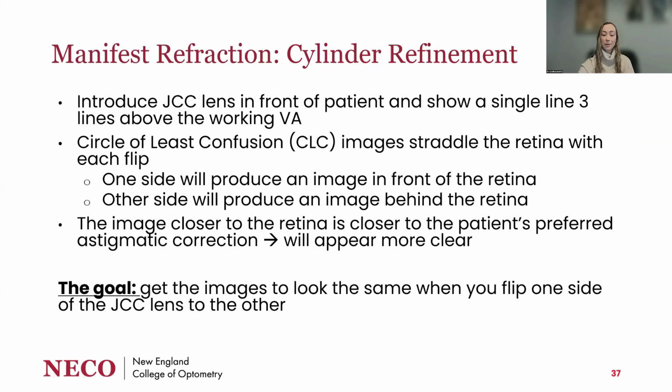We then move on to cylinder refinement. This is when we introduce the JCC lens in front of the patient and show a single line that's, again, 3 lines above their working VA. If the patient was 20/20, I recommend putting up a 20/40 line.